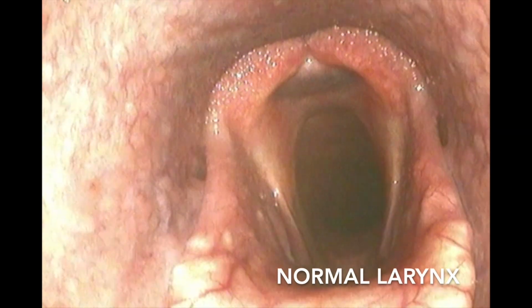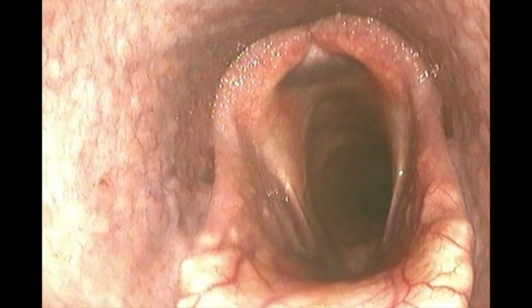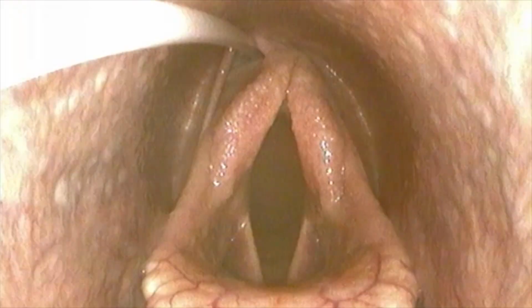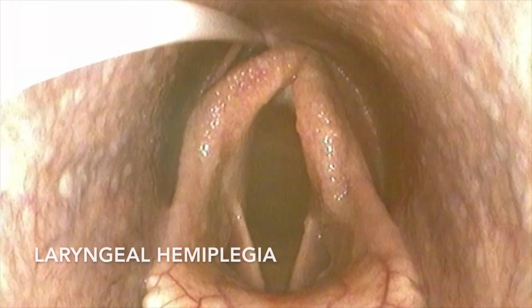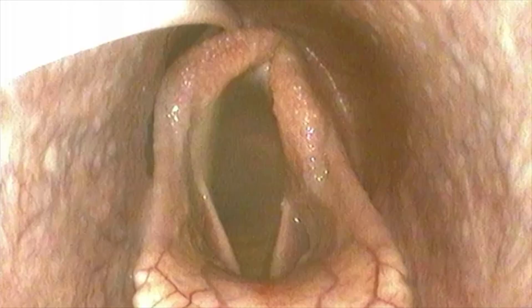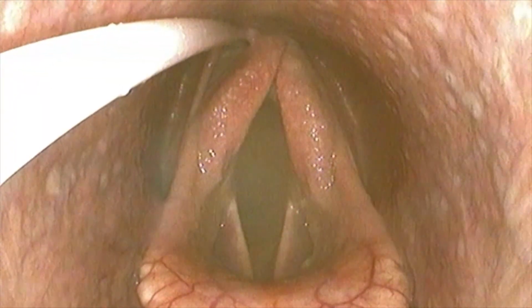In a horse with a normal larynx, both arytenoid cartilages should move smoothly and symmetrically. They should abduct fully during inspiration, creating a wide, open rim of glottis with no narrowing. This video shows recurrent laryngeal neuropathy grade 4, where you can see laryngeal hemiplegia as the left arytenoid is fully paralyzed. During inspiration, it lags or stays partially collapsed towards the midline. This creates an asymmetrical airway, reducing airflow and producing the classic roaring sound that is heard during exercise.